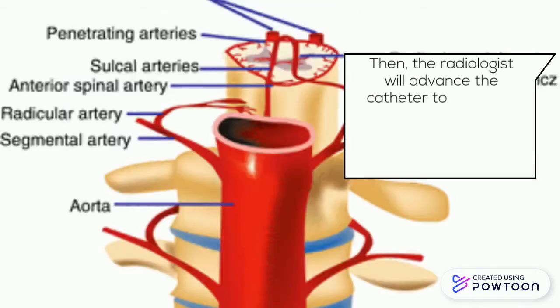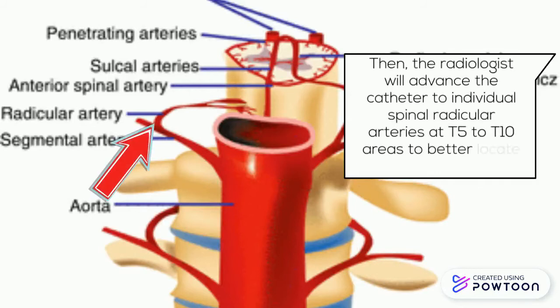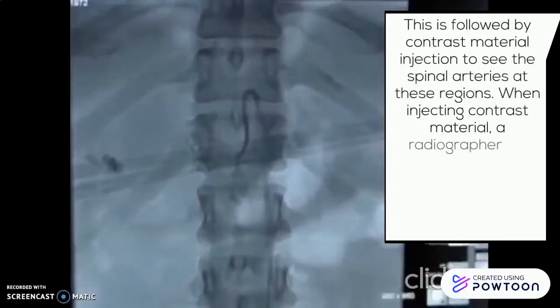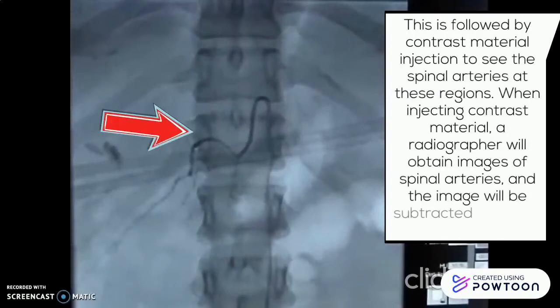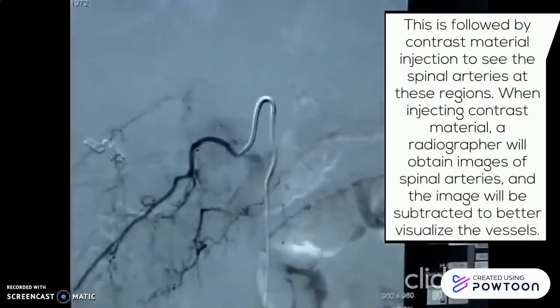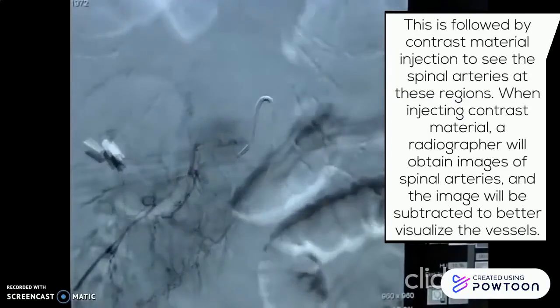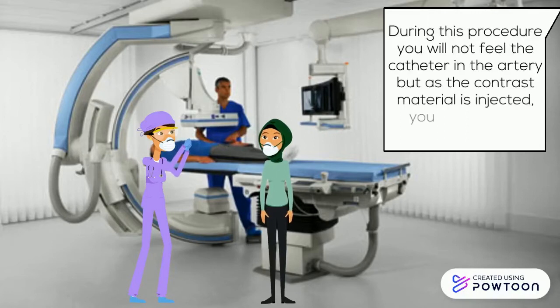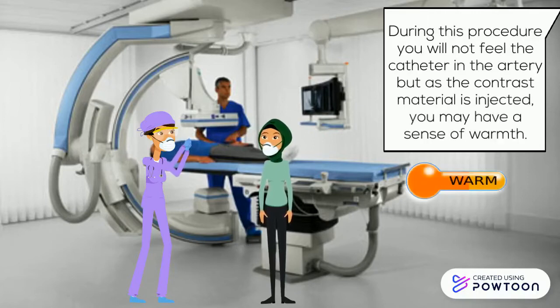Then, the radiologist will advance the catheter to individual spinal radicular arteries at T5 to T10 areas to better locate the fistula. This is followed by contrast material injection to see the spinal arteries at these regions. When injecting contrast material, a radiographer will obtain images of spinal arteries, and the image will be subtracted to better visualize the vessels. During this procedure you will not feel the catheter in the artery, but as the contrast material is injected, you may have a sense of warmth.